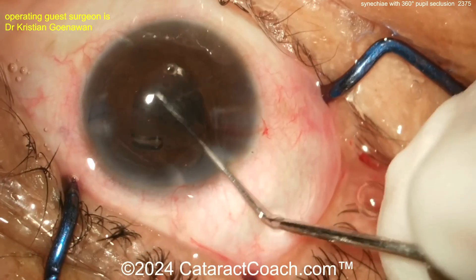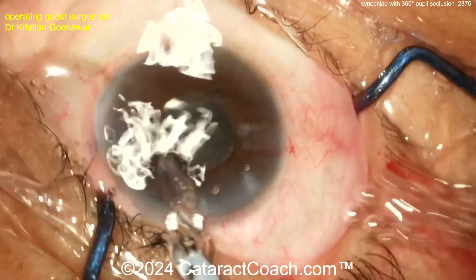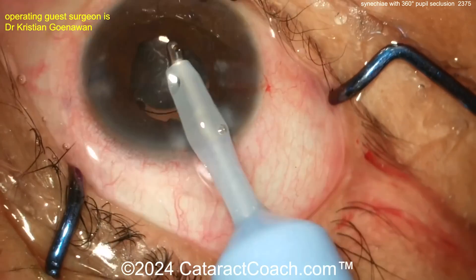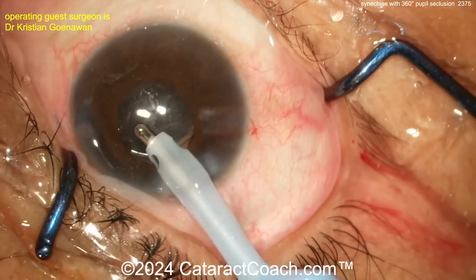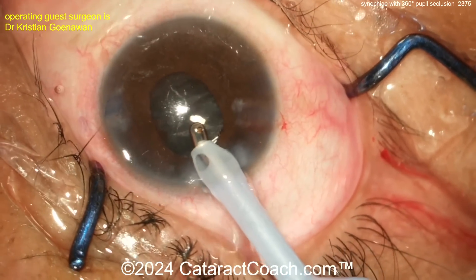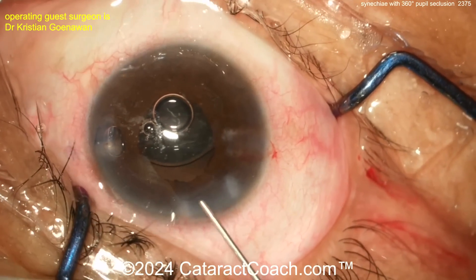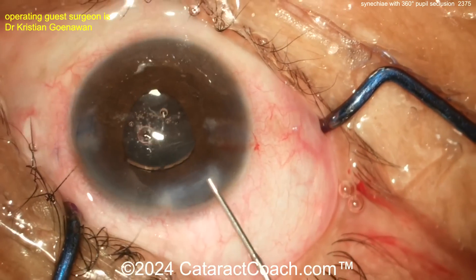Get that lens in — make sure the haptic goes into the bag. The clue that it's not in the bag is that the IOL won't center up well. Take out the viscoelastic, go behind it, and get the lens re-centered. I like to lift the iris with the chopper through the paracentesis or Sinskey hook and confirm the IOL is in the bag with both haptics seated. If you have one haptic in the bag and one in the sulcus, the lens will decenter and cause uveitis-glaucoma-hyphema (UGH) syndrome — the last thing you want in this already-uveitic patient. Make sure it's fully in the bag, otherwise you'll return to the OR with chronic inflammation from the haptic rubbing the back surface of the iris.